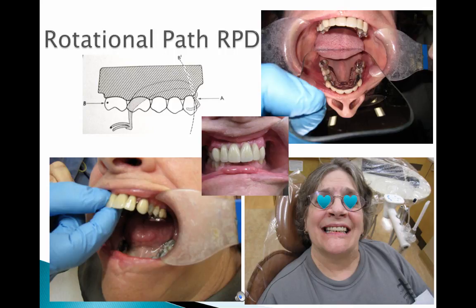First of all, in the upper left, you can see the illustration showing how this partial denture will work. The anterior portion of the partial will be seated first, as shown also in the picture on the lower left, and then the partial will be rotated into position. The direct retainer arms are located only on the posterior molars, and they must be located in that cervical 1/3.